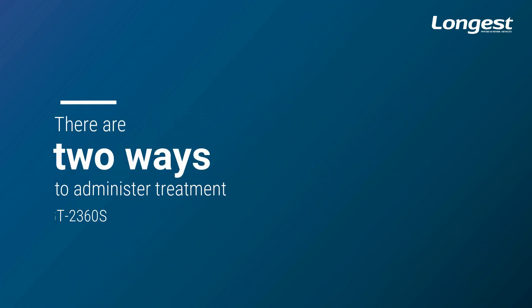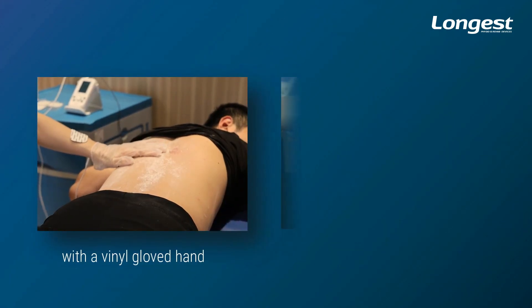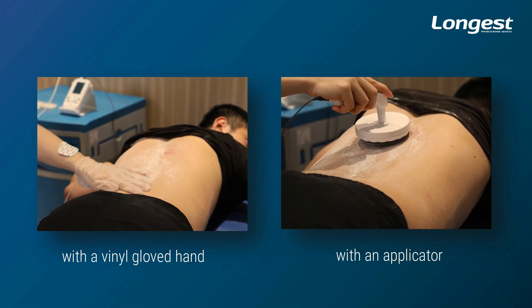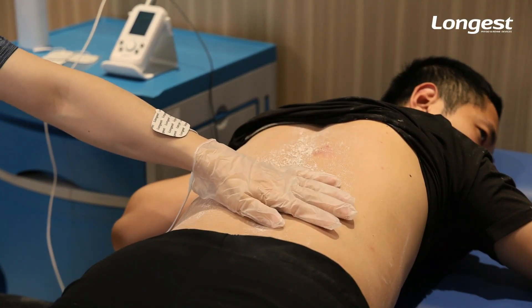There are two ways to administer the treatment using Powerashi LGT2360S — with a vinyl gloved hand, or with an applicator. In this video, we are going to show you how to treat patients with a vinyl gloved hand step by step.